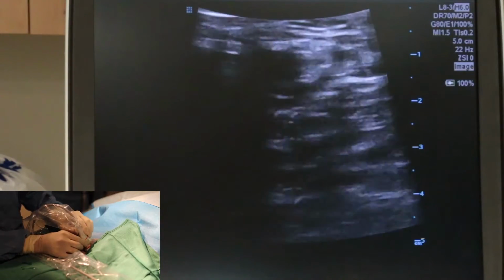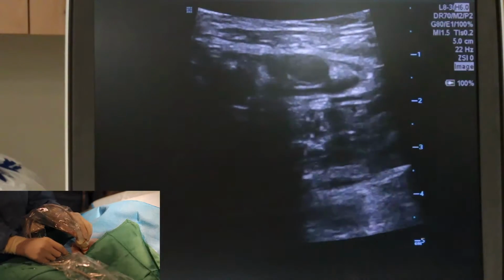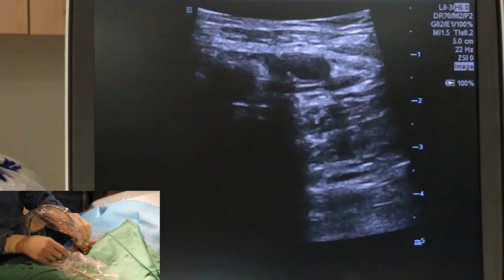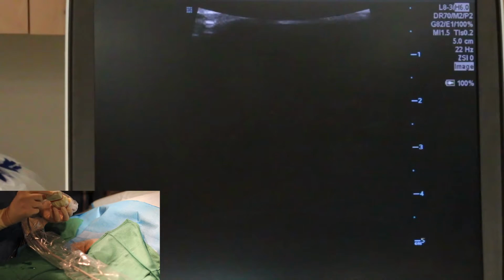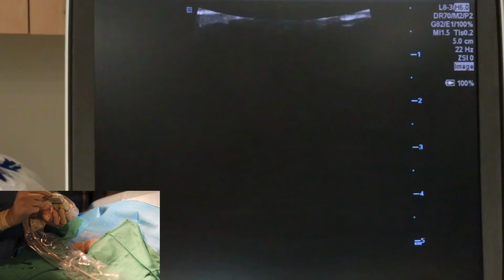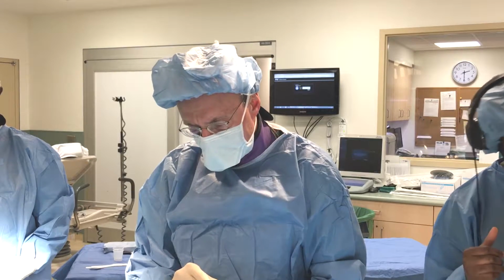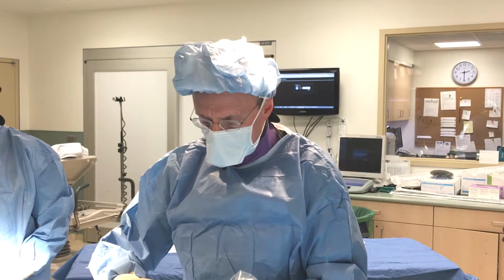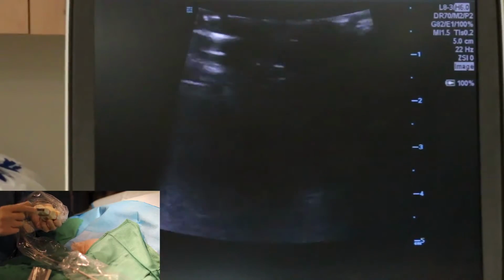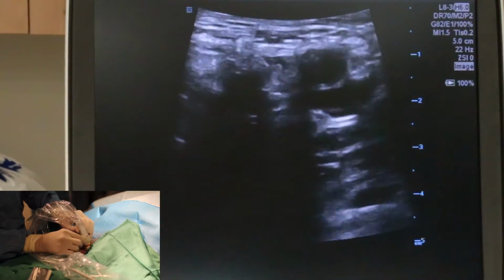We'll go ahead and access the groin. You can see there's a little bit of burnout, and that's probably due to a bubble in the system. So I'm going to try to get the bubble out of the space between the protective seal, the sheath, and the imaging probe. That looks a little bit better. I'll put some more gel on the outside, and here's a much better image now.